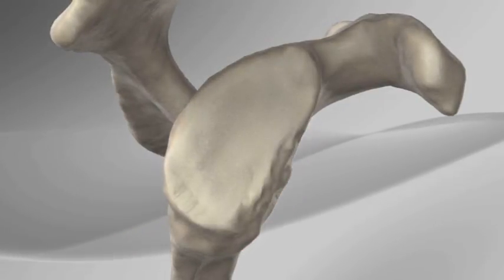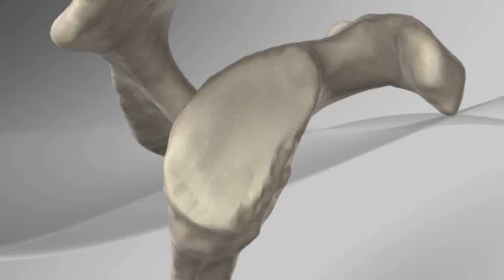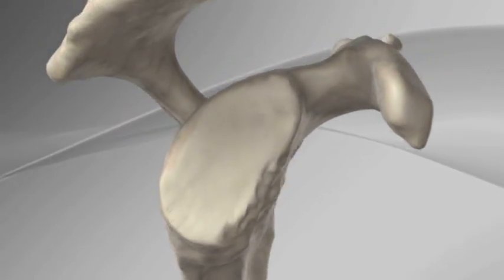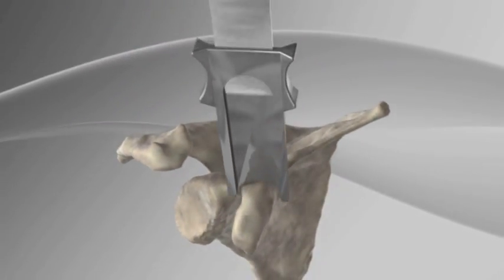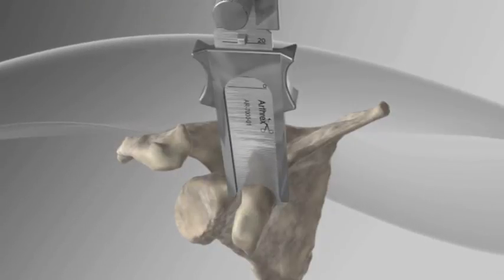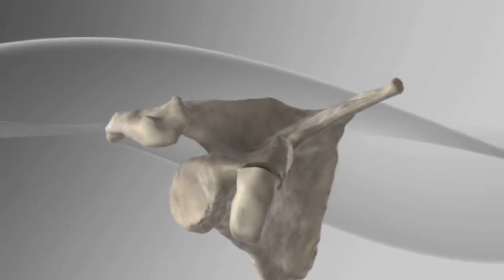The socket of the shoulder, or glenoid, can be damaged by multiple shoulder dislocations. This often results in bone loss of the anterior inferior portion of the glenoid. To replace this lost bone and prevent future dislocations, the surgeon will cut off a piece of the coracoid, a part of the shoulder blade.